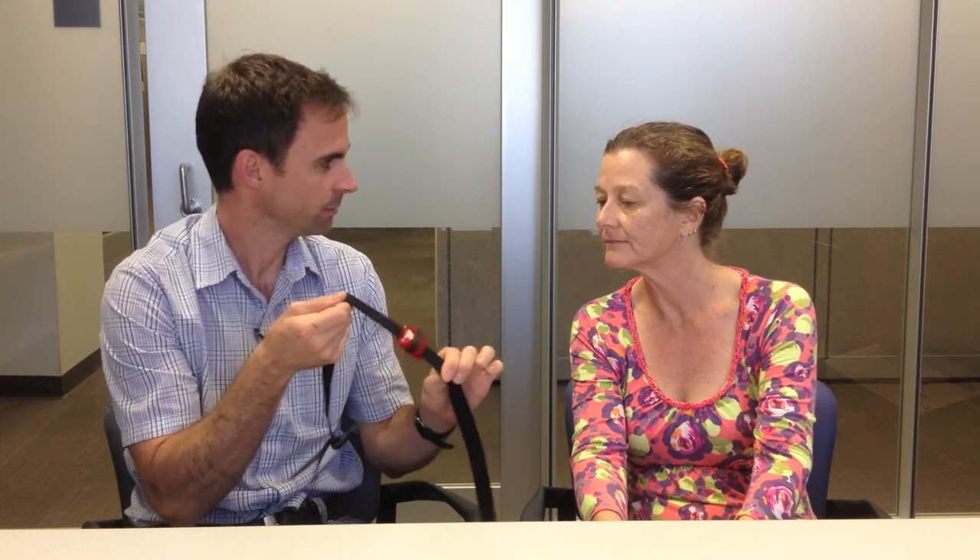This is an accelerometer. It's a very small instrument, and it's mounted on an elastic belt that you're going to wear over your right hip. The accelerometer is a sensitive piece of equipment that measures vertical displacement at your hip, and also possibly side to side depending on how the accelerometer is set up. Because of the information that it records, we can then extrapolate how much activity you're achieving throughout the day.